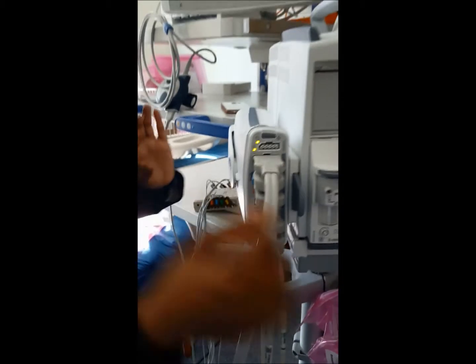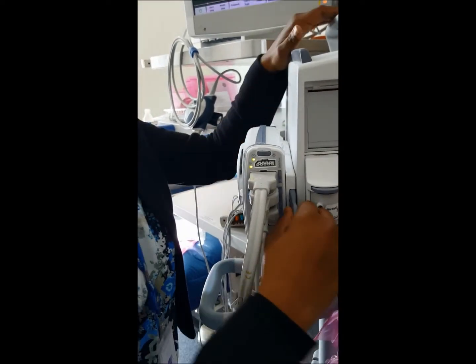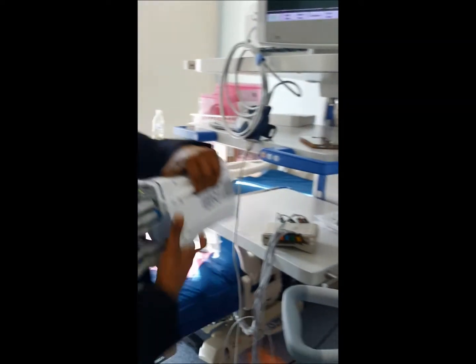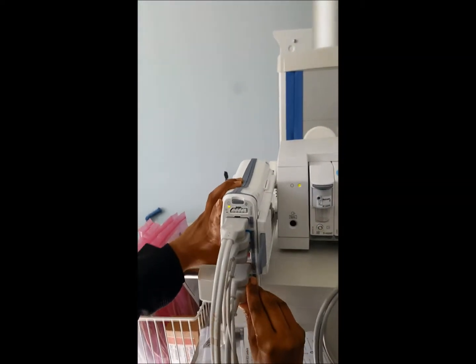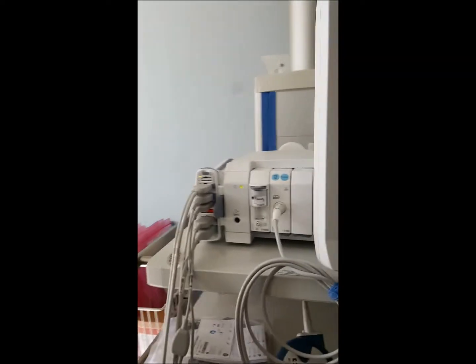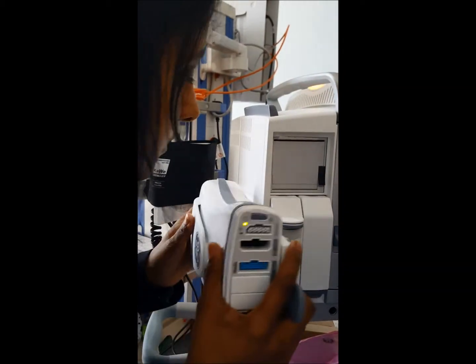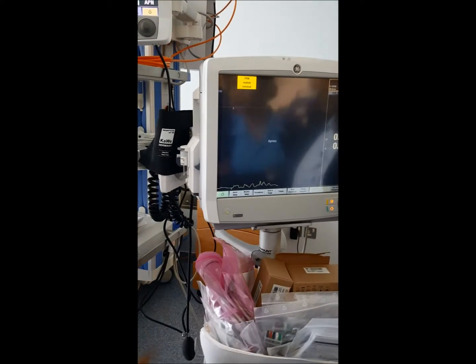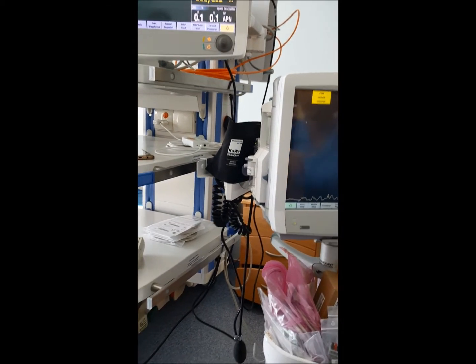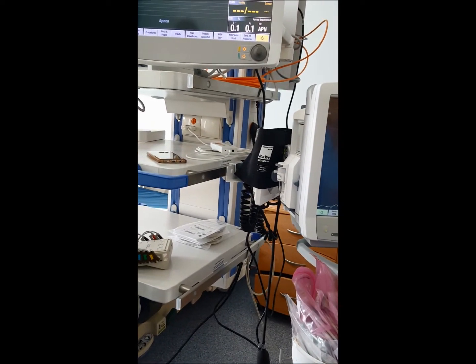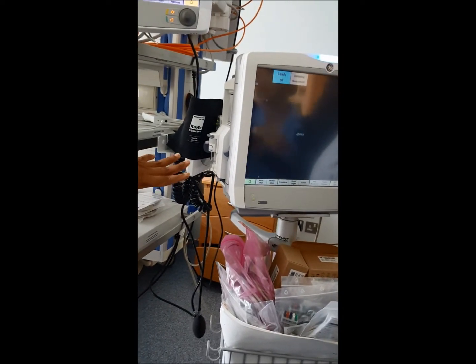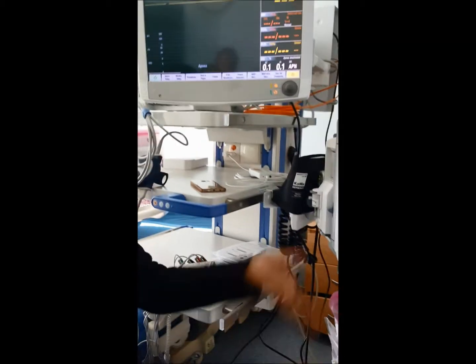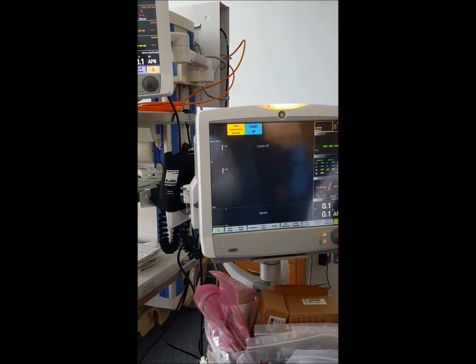To remove the PDM, pull the latch and take it out. To reattach, slide it back in until you hear the locking sound — that confirms you are still monitoring the patient. Because you take the whole PDM with its memory, all data and monitoring continues seamlessly.